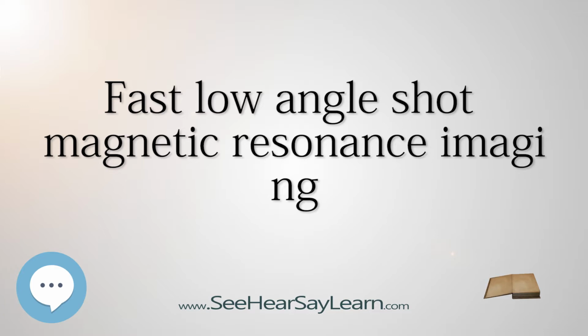In either case, repetition times are as short as 2 to 10 milliseconds, so that the use of 64 to 256 repetitions results in image acquisition times of about 0.1 to 2.5 seconds for a two-dimensional image.